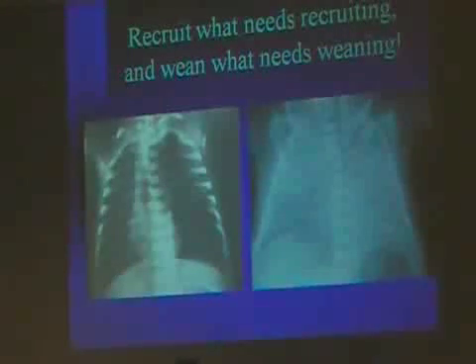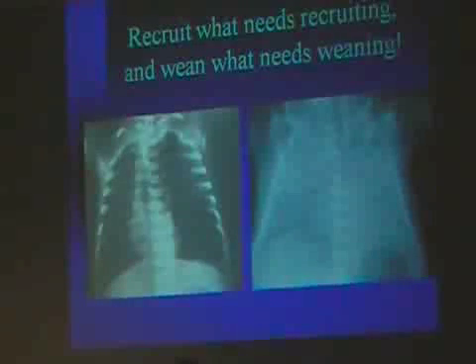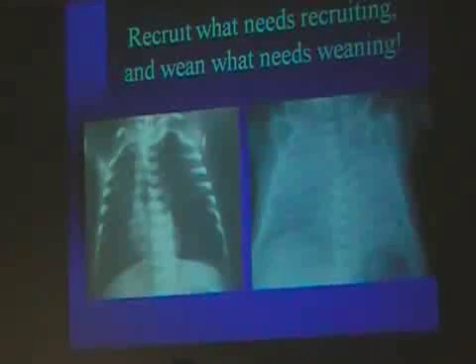So what he does is every baby in that unit is treated with an oscillator. They don't even own a conventional ventilator, last time I heard. But he does such beautiful oscillator work, they don't need it. He sits down with the baby, he recruits them, and it's amazing. I've got great articles from him if you'd like to look at them. Usually takes about 25 mean airway pressure, which just scares the hell out of me. These are preemies that have not had surfactant.